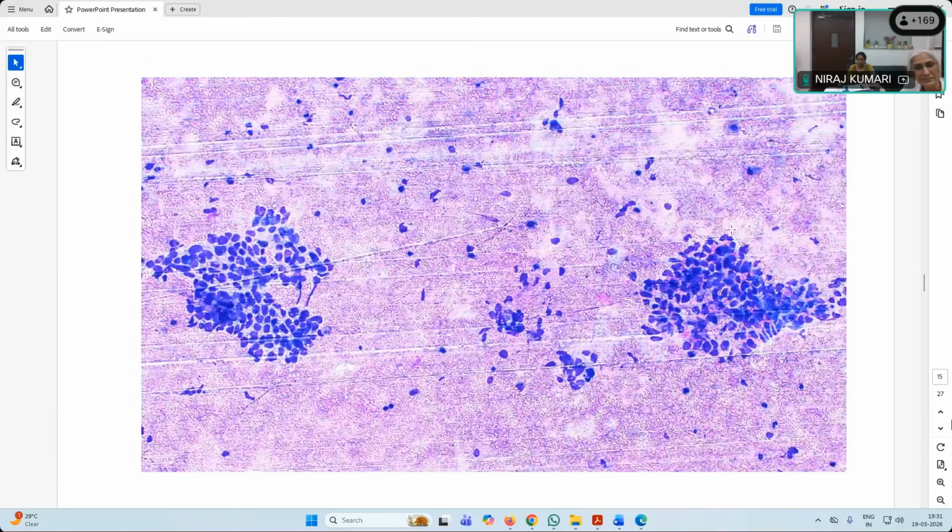Again here. So here, what can you see? So you have very loosely cohesive clusters, isn't it? Dr. Preeta, are you there?